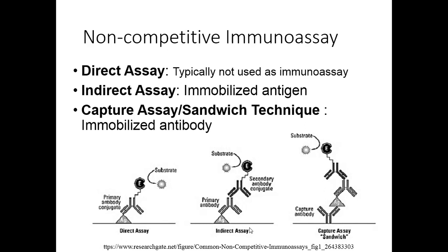This is equivalent really to the antibody capture from figure 11-2 on page 158 of your book. It's a slightly different form, because remember I told you we can immobilize either antigen or antibody to the solid surface. In this example, they bound antigen. They immobilized some reagent antigen. It can be antibody, and in the book, is it antigen? Can't remember right now. Let's see. Yep, it is antigen. Okay, but it can be antibody here as well.